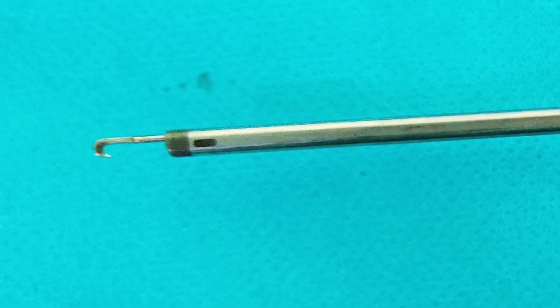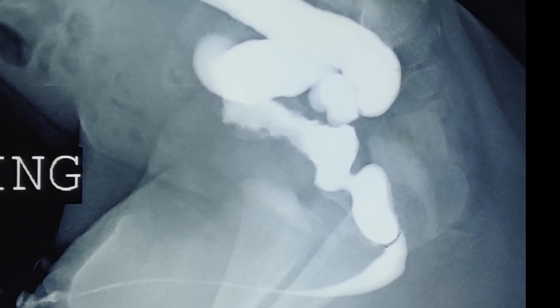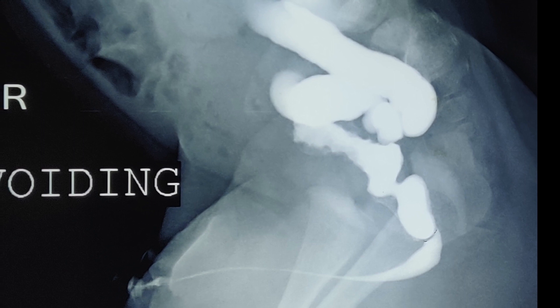The tip of the cold knife looks sickle-shaped. This is a 5-month-old boy who presented with significant renal impairment, electrolyte imbalance, and UTI. A voiding cystogram revealed a classical posterior urethral valve with bladder neck hypertrophy, trabeculated bladder, and bilateral vesico-ureteric reflux.